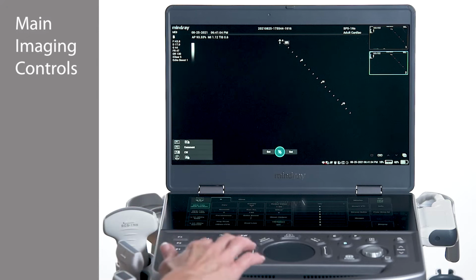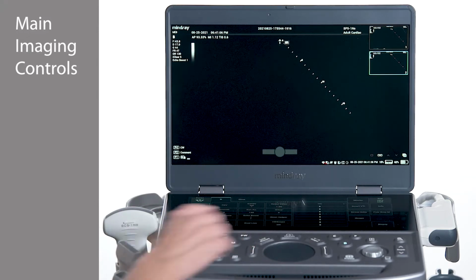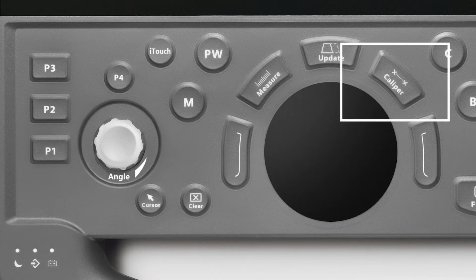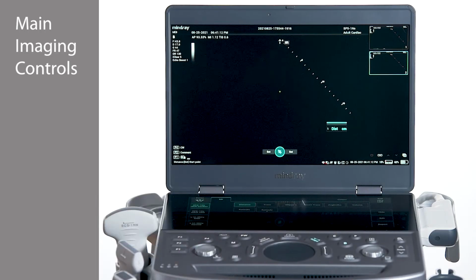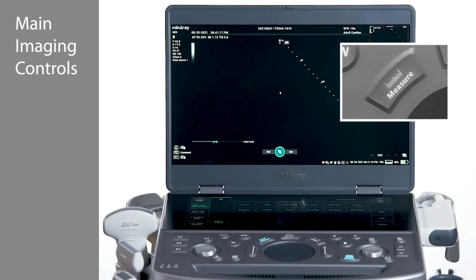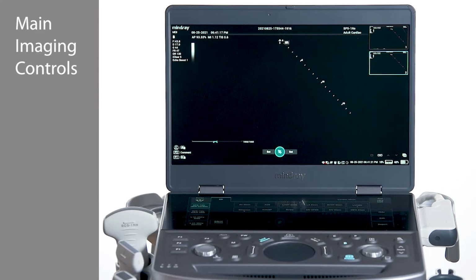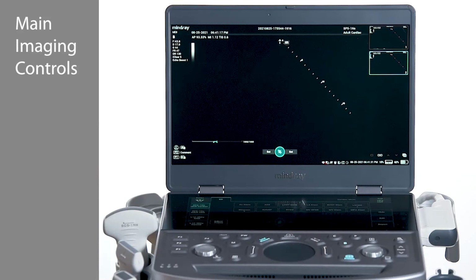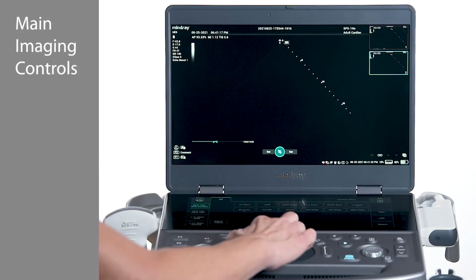Measurements on the ME8 are divided into two types, caliper and measure. The caliper key on the right side of the trackpad will take generic calculations like distance, area, and volume. When pressing the measure button, which is located on the left side of the trackpad, there will be labeled measurements specific to the exam type. For example, crown rump length in OB or ejection fraction in cardiac. These measurements will go into a report.